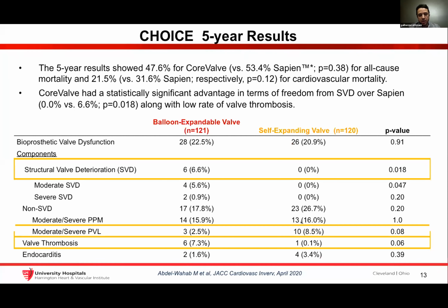comparing these two technologies. There was, although not in terms of paravalvular leak compared with CoreValve, but however, importantly to emphasize the fact that these are not the current iterations of the valves, a higher rate of valve thrombosis with the balloon expandable valve.